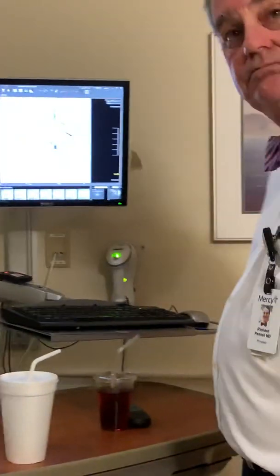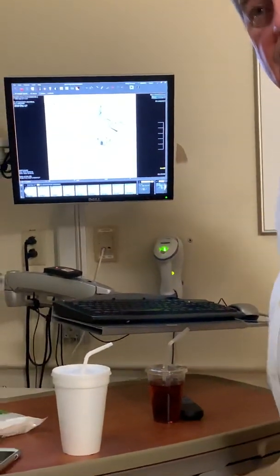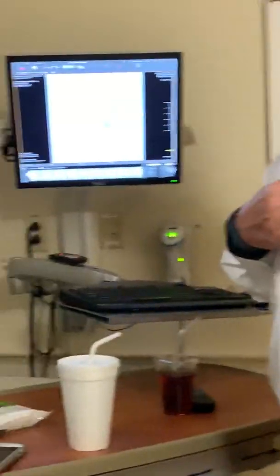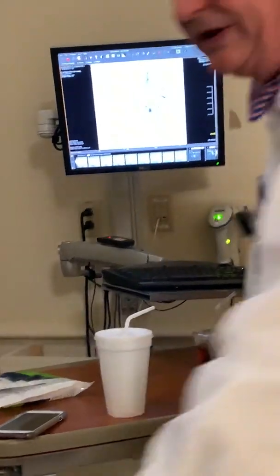So this is in her, I'm sorry, but why is her bowel so affected by the heart? I guess I'm confused by that. This isn't the heart. These are her arteries. Oh, no. I'm so sorry. I thought it was her heart. No, this has nothing to do with her heart. Okay, yeah, I'm so sorry. This is down in her intestines.